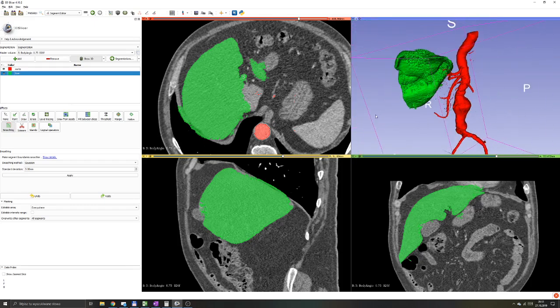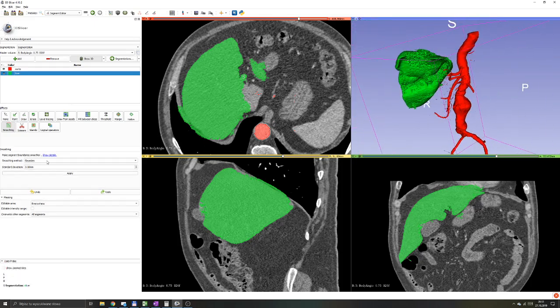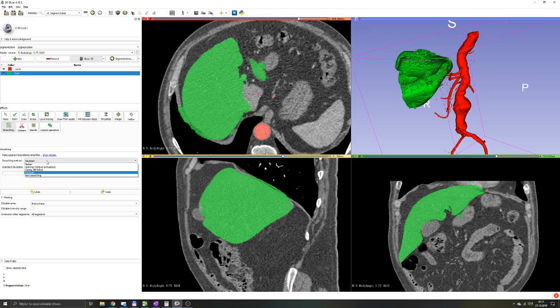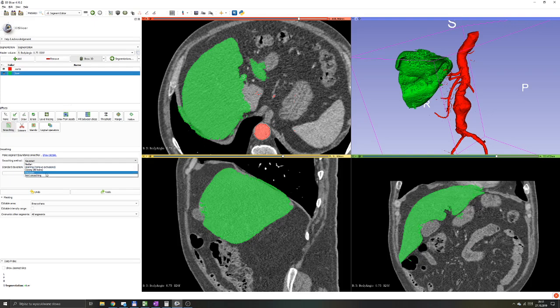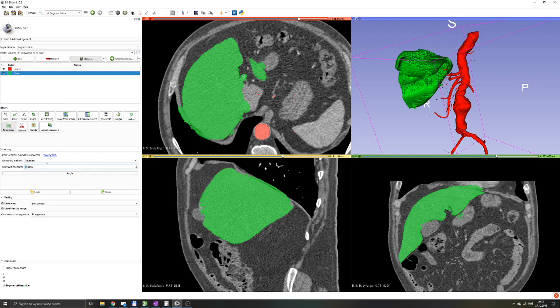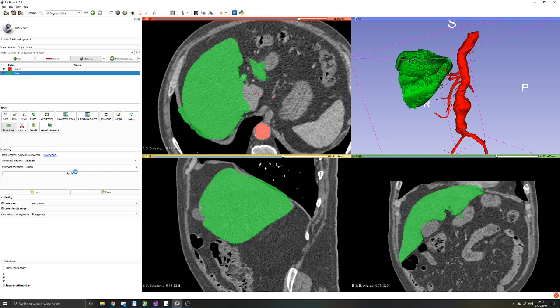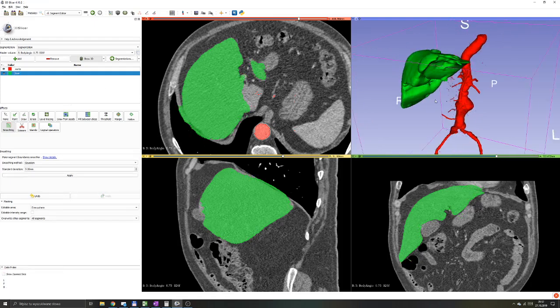But in case of liver, I think we need something strong, and the smoothing method should take everything into consideration. Gaussian smoothing is a really strong algorithm for that. Using different parameters, you have to play a little bit with those parameters. It might be too much or too little depending on your study. I'm going with default three millimeters, and once you apply it, it will process and apply the smoothing to your selected segmentation layer.